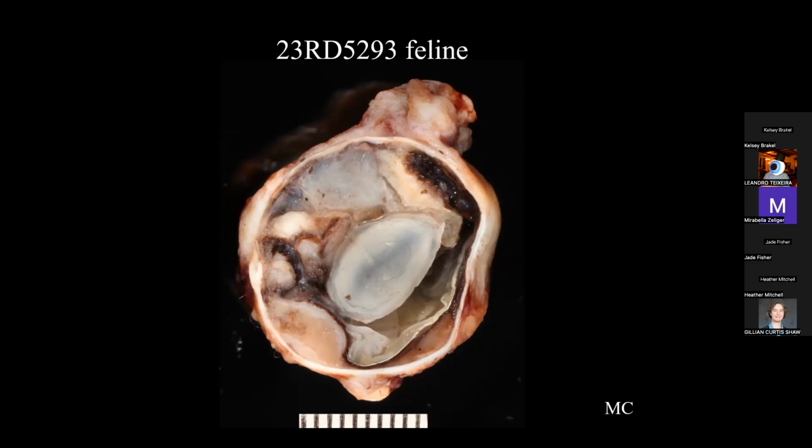On gross examination, first of all, still in that chair. Here's the optic nerve down here. We have a tag of conjunctiva up here. The cut may be a little bit peripheral in terms of catching cornea, which is part of the reason why I think it kind of looks like we have sclera all the way around. But regardless, the main feature is definitely right here for everybody to see.